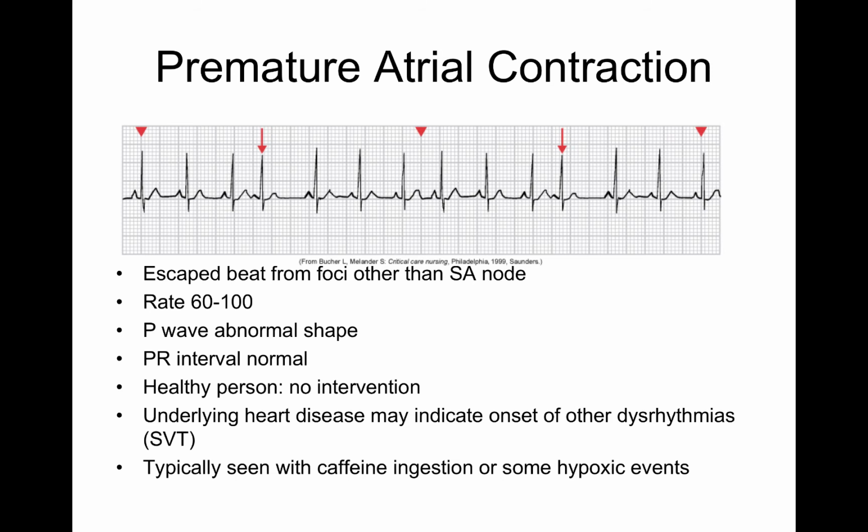The next thing that we have is premature beats. Premature beats are different. So you will have a sinus atrial rhythm, or sinus rhythm, that comes from the SA node, but what happens is there might be a little spot at the top of the heart that gets a little sensitive and says, you know what, I want to have my fun too, and I want to beat. And so what will happen is the SA node will beat, and it says, I'm going to beat my drum too. And so what happens is we have what we call a premature complex.